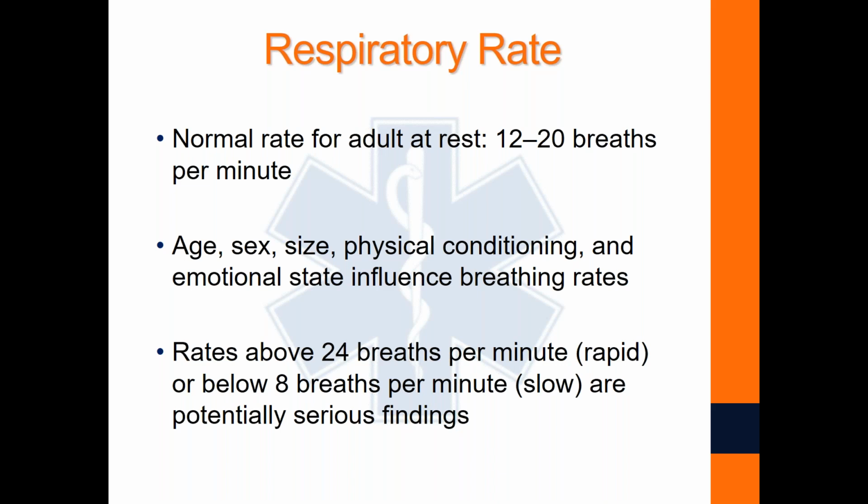whether it's respiratory distress and we just put them on some oxygen, 15 liters per minute with a non-rebreather mask, or it's respiratory failure because they've been battling this for longer than we know, and we have to ventilate them at 1 breath every 6 seconds with a BVM.